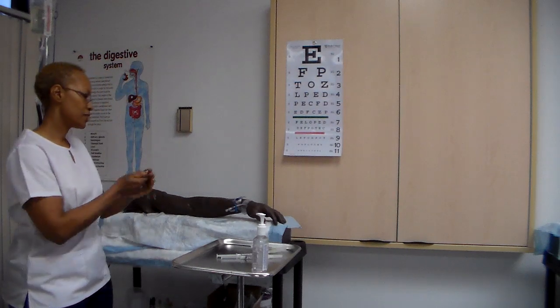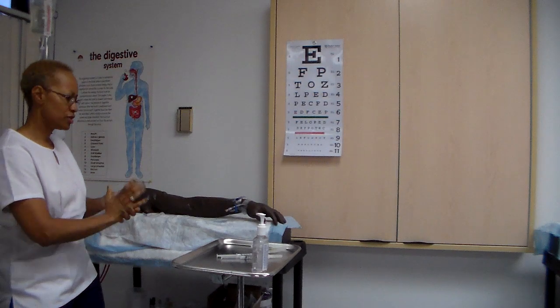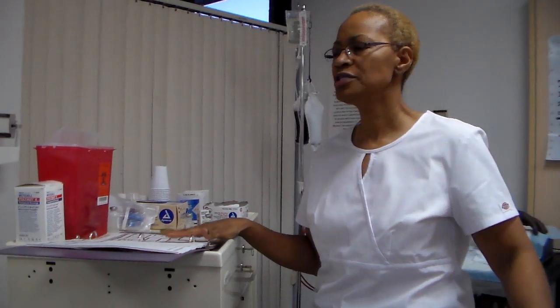Report any adverse reactions immediately to healthcare provider because they could be life-threatening. Okay. Client's response indicates need for additional medical therapy. Record client's response to medication in nurse's notes. Okay, so I would wash my hands and tell my client that I'll be back to check on them, and then go out to my cart and do my documentation, making sure that I assess that site really well so that I can have something to compare it to when I go back in the room again.